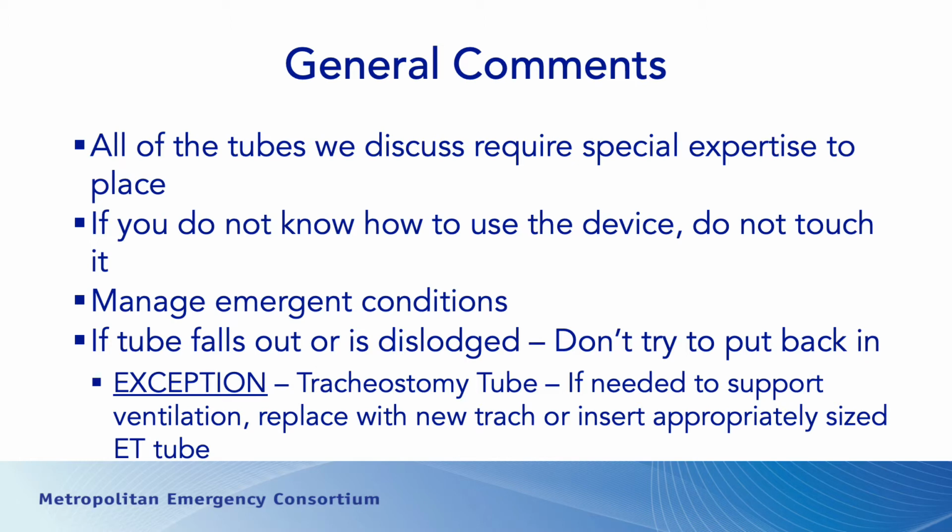participate in. And then the last general comment about this subject is if a tube falls out or becomes dislodged, don't try to put it back in. So if you have a PICC line that's starting to fall out, we don't try to put them back in. Just secure it in place and move the patient.